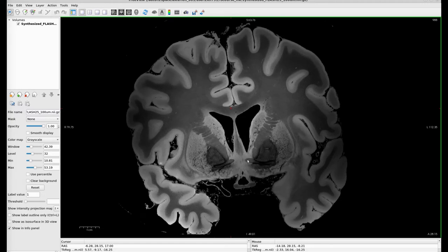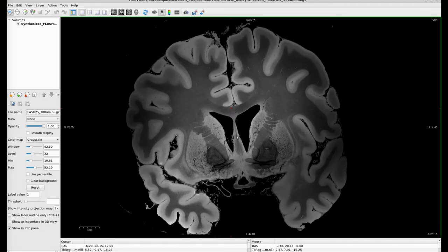Now we're starting to see some commissures. We've got the corpus callosum right here, which is that main highway between the two hemispheres of the brain. We're starting to see the septum pellucidum — this is not a commissure, but it is a membrane that separates the two hemispheres and the two ventricles between the hemispheres. We've got the anterior commissure right here on both sides of the brain, and I'll keep scrolling.